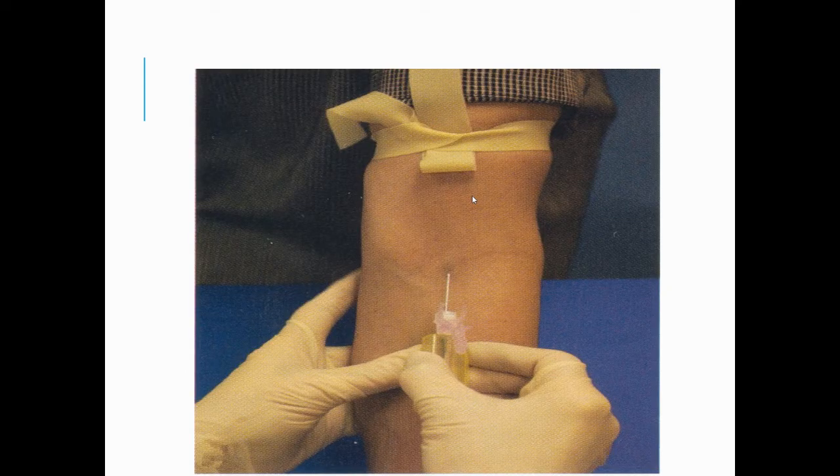Just like this, he used his thumb so that the skin does not move. So, so that you can see the vein, it should be visible. And again, since this is the site of collection, your tourniquet is 3 to 4 inches above.